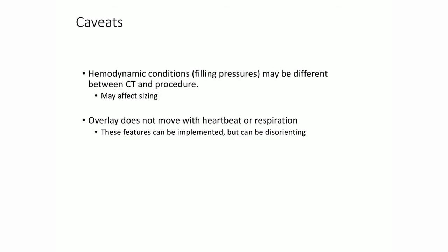And the other thing is that the 3D overlay does not move with the heartbeat or the respiration. So these features can be implemented, but this can be somewhat disorienting to the operator, because there would be a lot of movement on the screen, both the catheters, the structures, and the overlay. So we're not sure if it's necessarily the right way to go. Having these structures fixed on the screen may potentially be the best way to perform the procedure.